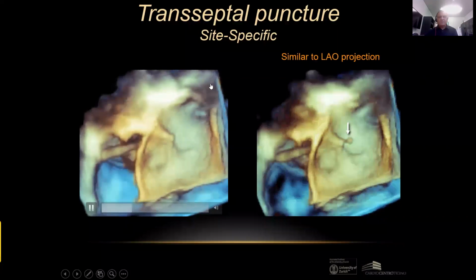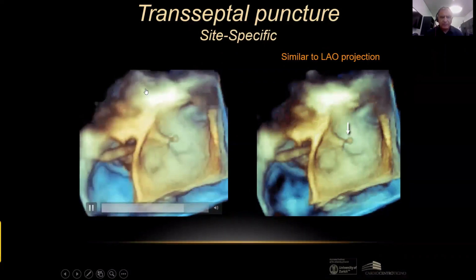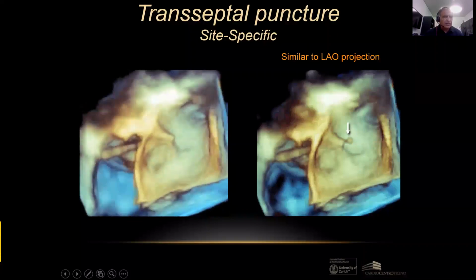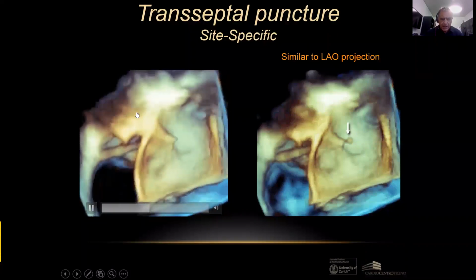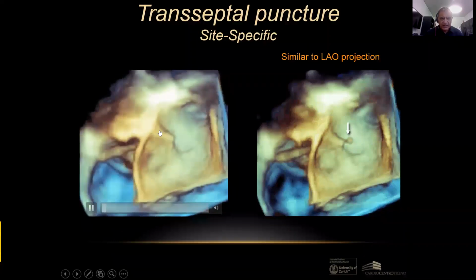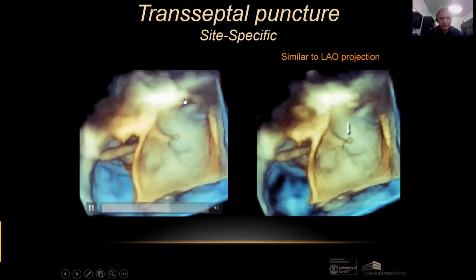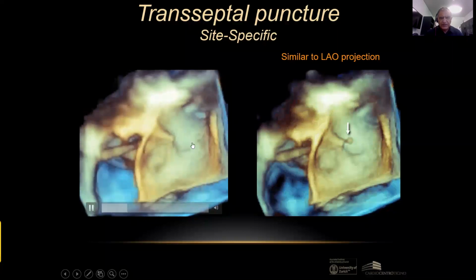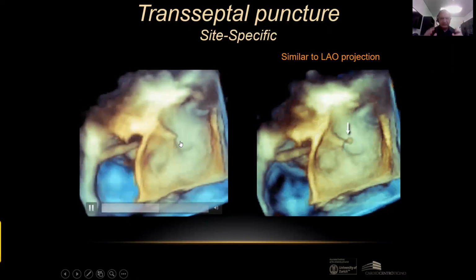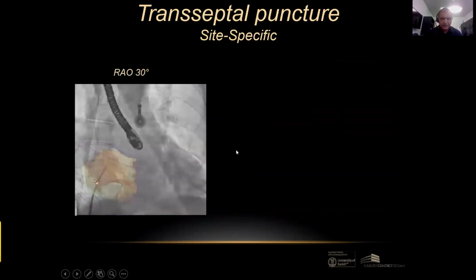And this is a puncture that we usually do with 3D echocardiography. This is a kind of left anterior oblique projection and fluoroscopy, and then you can see the tenting that you can see here. This is a right superior pulmonary vein, and then you can see how easy it is to understand this kind of puncture.